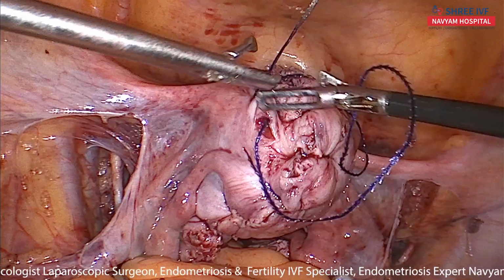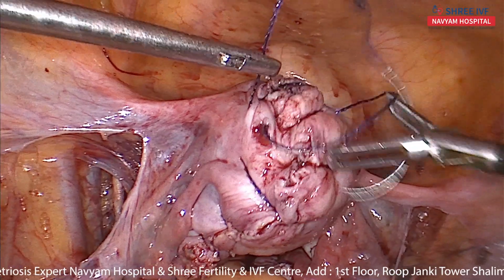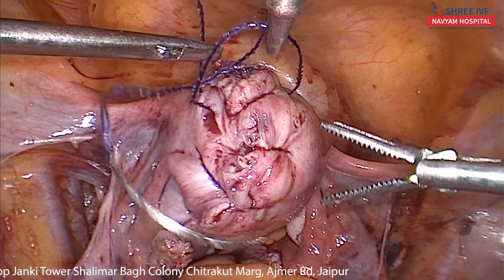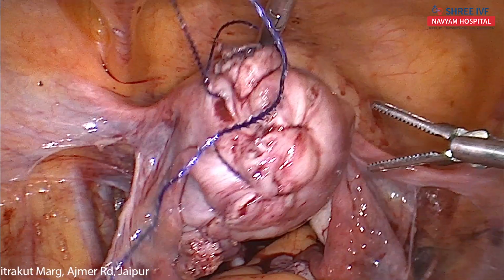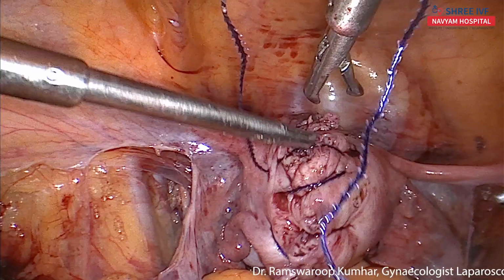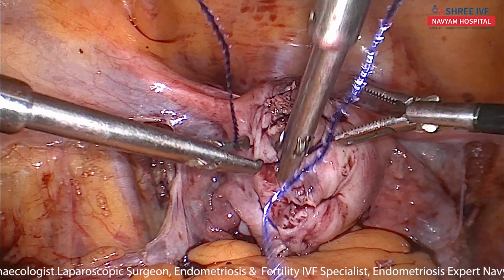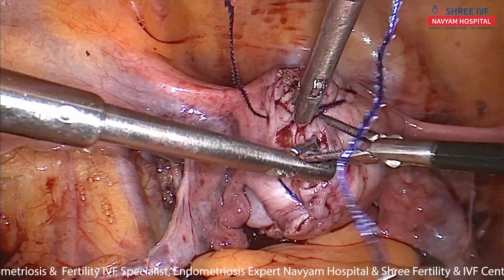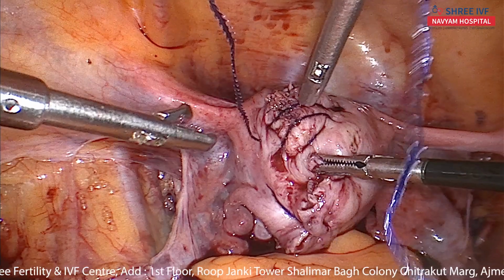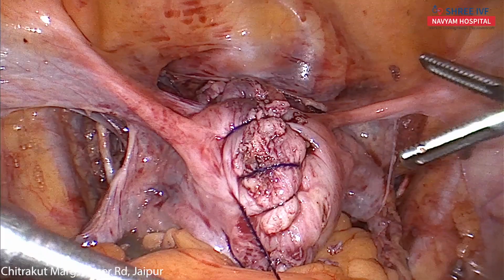I think it's fine. No, no, don't lock it. One more round I want to take. This suture slightly interiorly. Now, good.